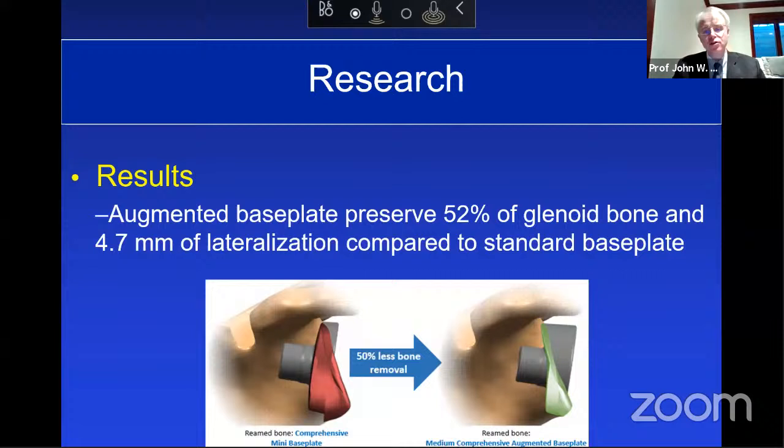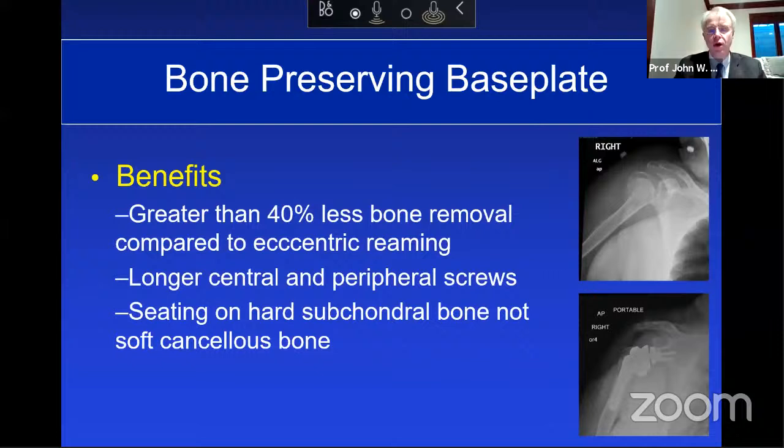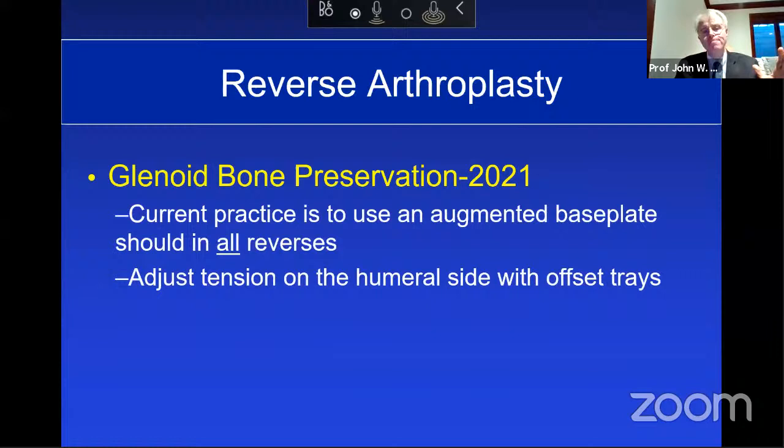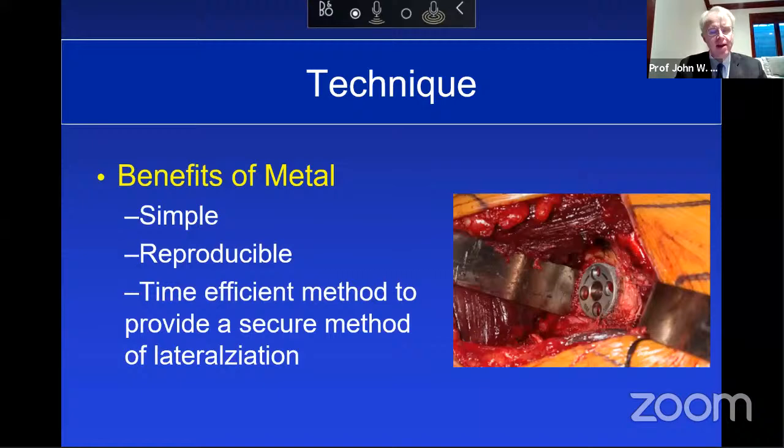You can see on the left how much bone you remove with reaming and how an augmented base plate allows you to preserve bone and the best quality bone. So again, 40 to 50% bone savings and preserving the best quality bone with less impingement. So a number of us now use an augmented base plate to create the tilt in all our reverses and then adjust the tension on the humeral side, as Professor O showed, with offset trays. So the benefits of metal: it's a simple, reproducible, and time-efficient method to provide lateralization.